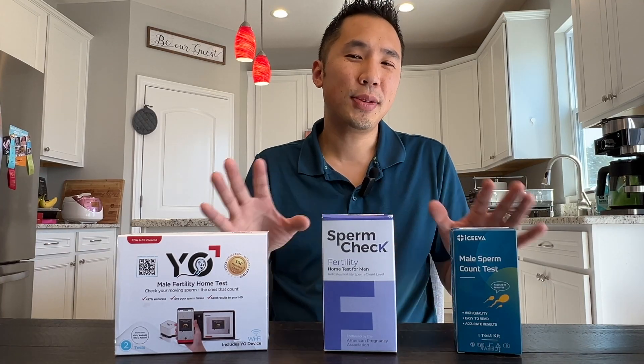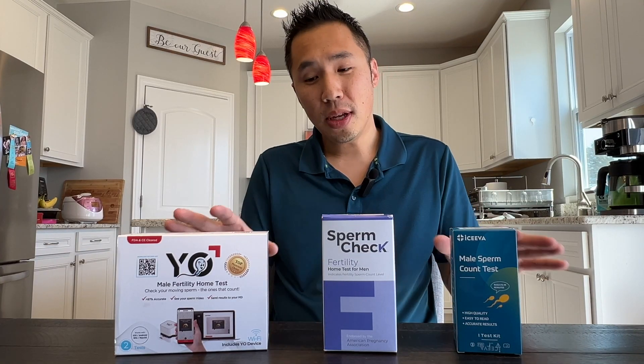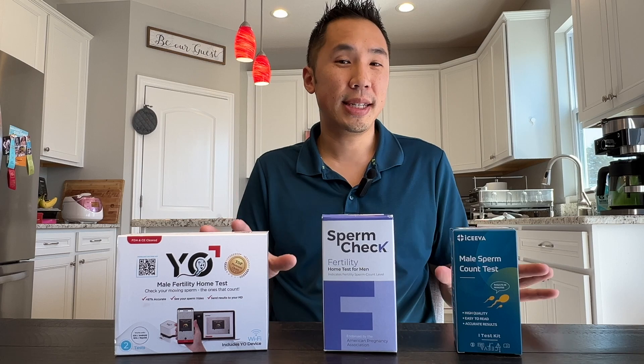Today, I'm going to be giving you a detailed review and comparison between these three male home fertility tests.